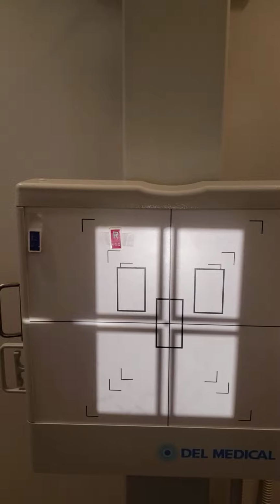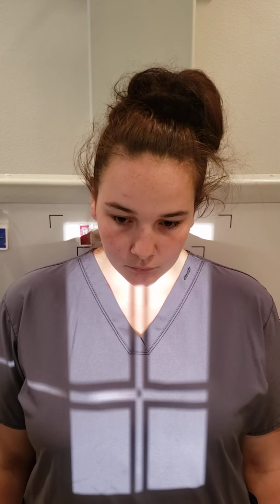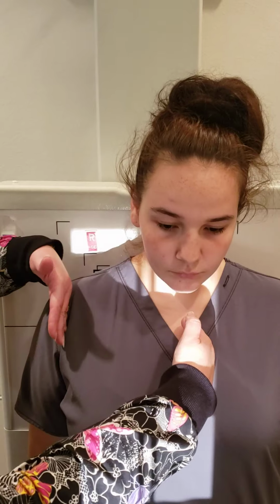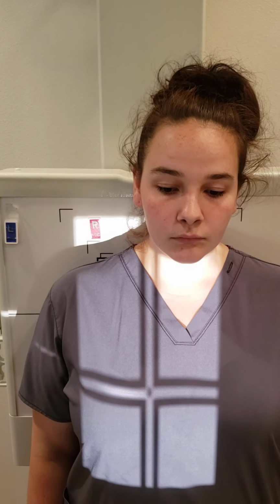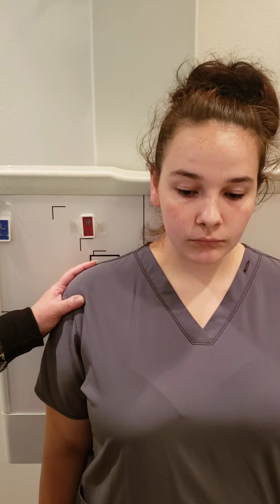Let's go ahead and get our patient in. Patient will place their back against the image receptor, and I want you to step to your left, and we want to get the patient midway with the upper thorax. So we do want to make sure that we're getting collimation of at least 1 inch of the opposite side. So I'm going to have her step over just a little bit more.